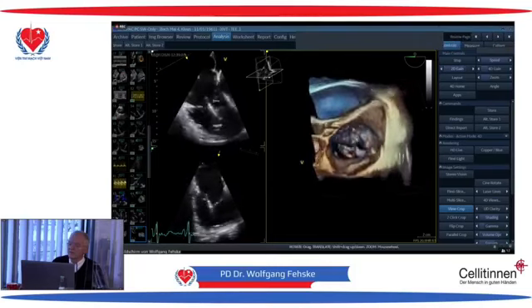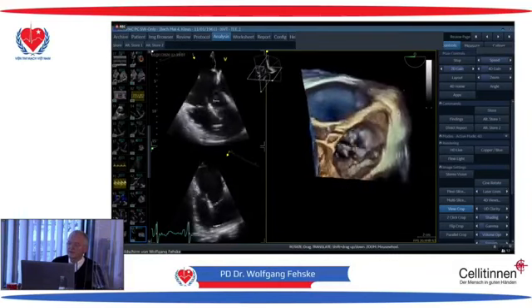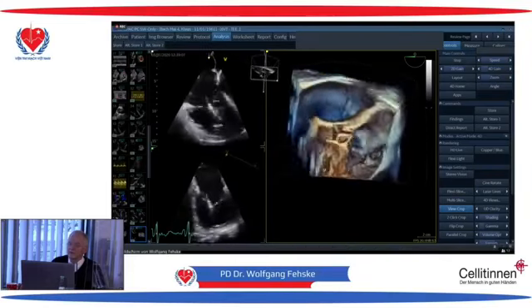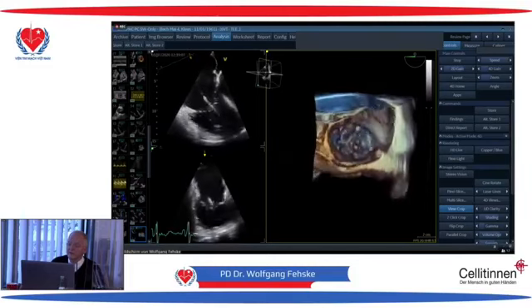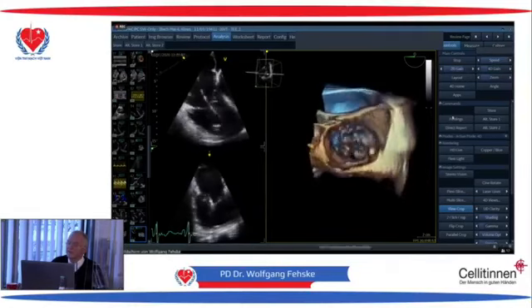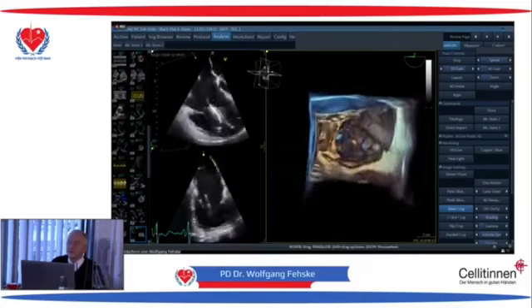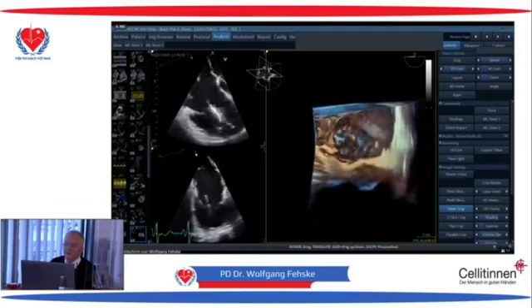You see that what Quang Bao told us before. So this is the correct orientation. You see the tricuspid, you see the mitral valve is somewhere here. Then you have the aorta there, and in this orientation you have the anterior leaflet, which is here. You have the septal leaflet there, and you have the posterior leaflet behind. But this is very weak to be demonstrated. You see here it's a little bit better. Okay, so the tricuspid valve can be much better displayed from the transthoracic echocardiography.